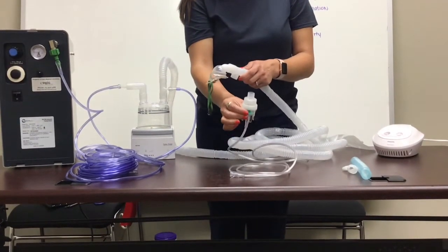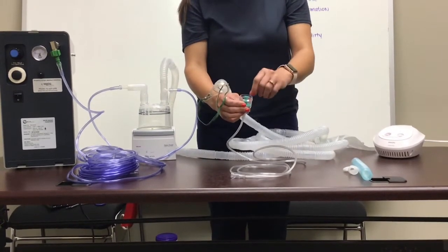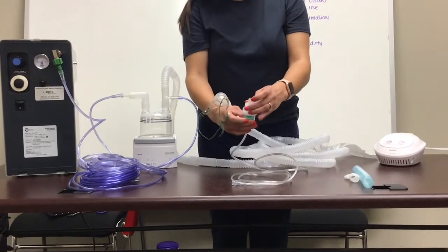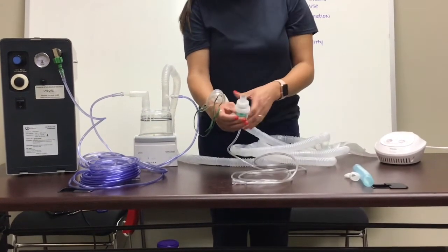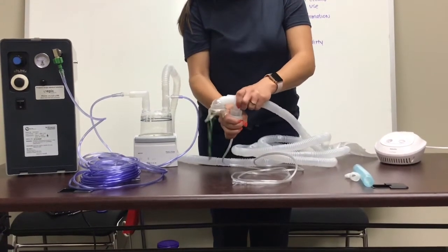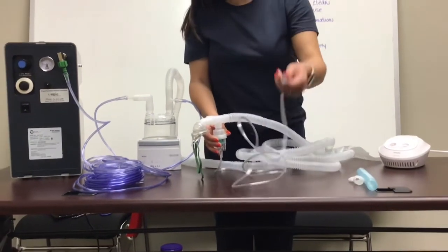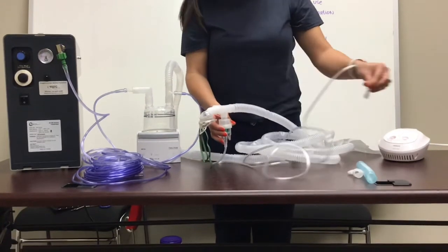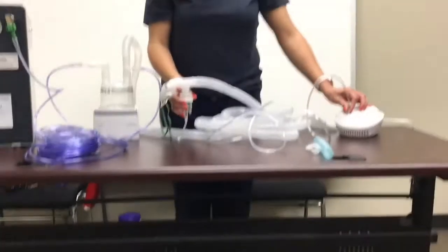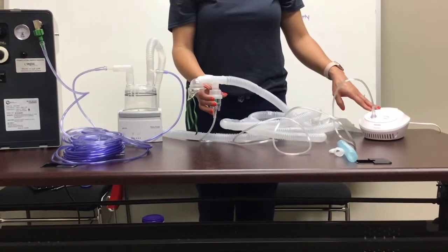You will get your nebulizer cup, opening your lid, filling it up with your prescribed medication, and making sure your lid is closed securely. Then you will attach your cup to the T adapter, making sure that is also tight and secure. You will then use the end of your nebulizer tubing and attach that to the port on your nebulizer machine. And now you are ready to turn on your nebulizer machine and give your nebulizer treatment.